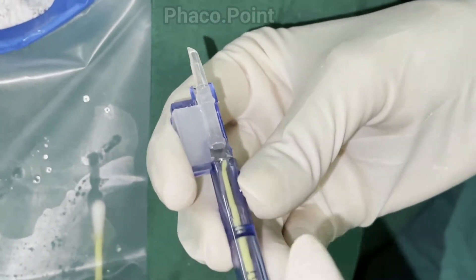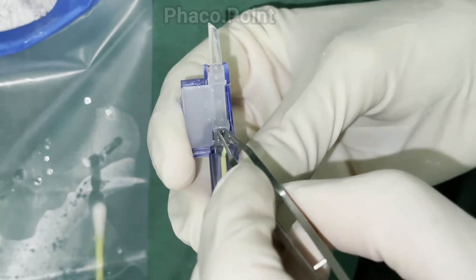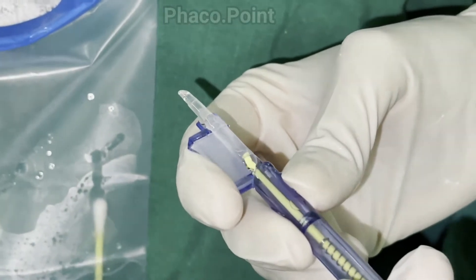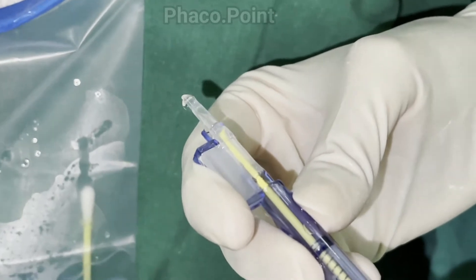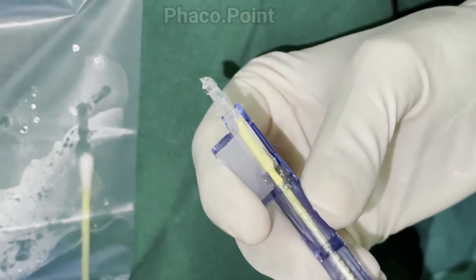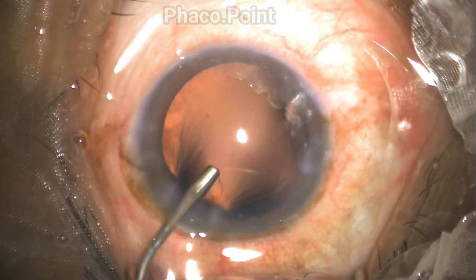Having done so, one needs to confirm that the entire lens is within its housing, and also ensure the position of the trailing haptic and see where the leading haptic lies. Once more, under visualization, push the lens anteriorly such that the leading haptic reaches up to the nozzle.